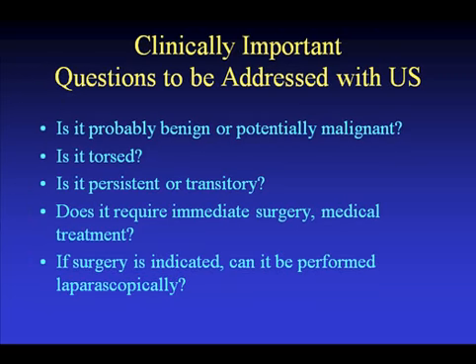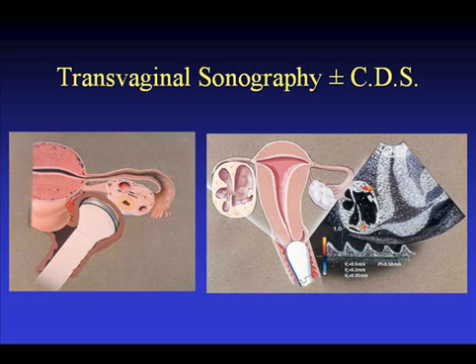The clinically important questions are: is it benign or potentially malignant? Is it torsed? Is it persistent or transitory? Does it require immediate surgery or medical treatment? And if surgery is indicated, can it be performed laparoscopically? And these are all questions that need to be answered with ultrasound.